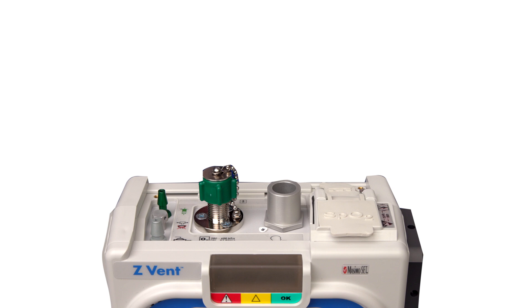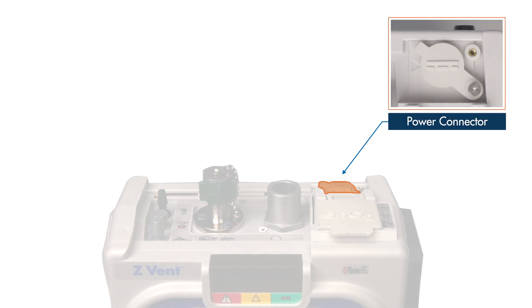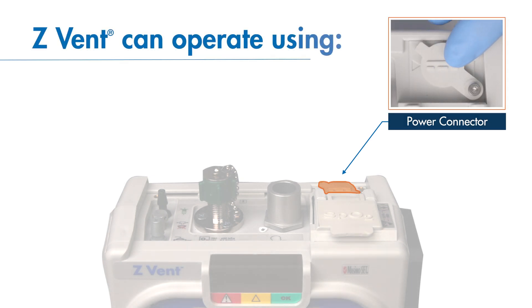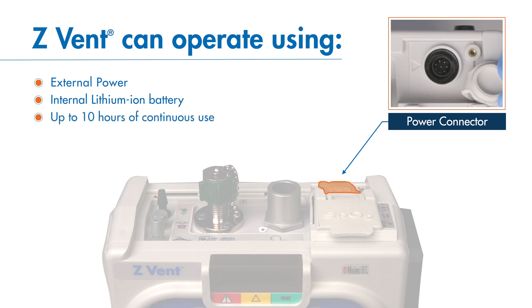Let us begin by exploring the top of the device. At the top right corner is the external power connector, located under the rubber cap notated by the solid and dashed line. The Z-VENT can operate using external power or from its internal lithium ion battery, which provides up to 10 hours of continuous use.